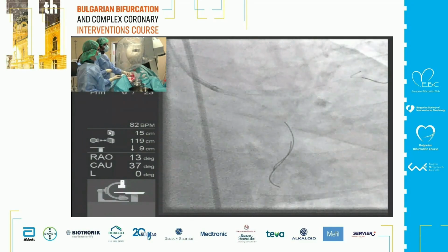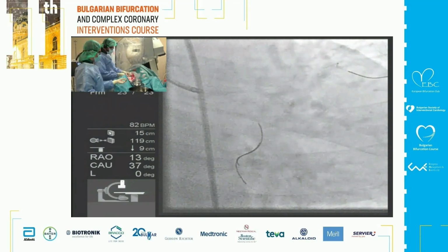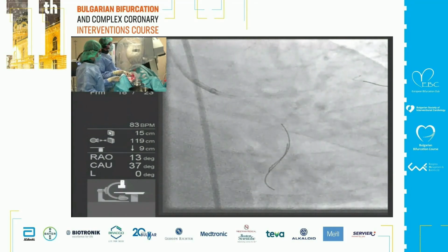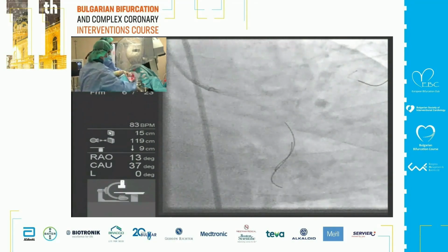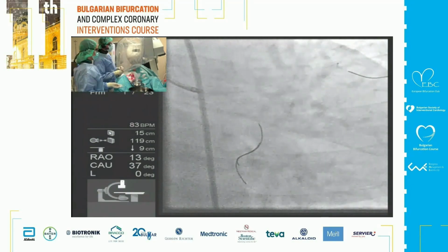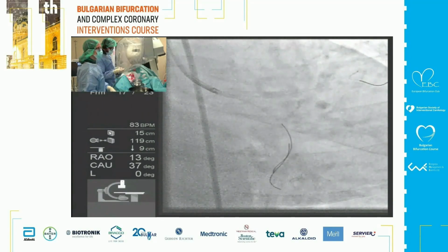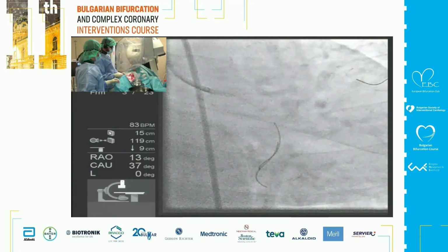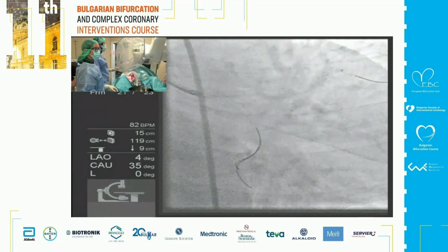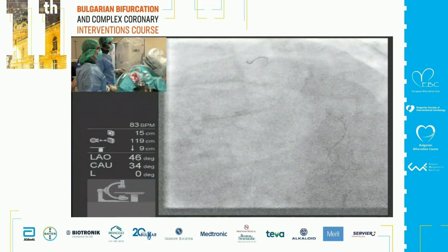My colleague Thierry Lefebvre will insist to do it again because he won't be convinced. You have a wire inside. Just do a quick cine without injection to see the two wires. If the wires are well separated, this is good. Yes, they are separated. You won't see much more than this.